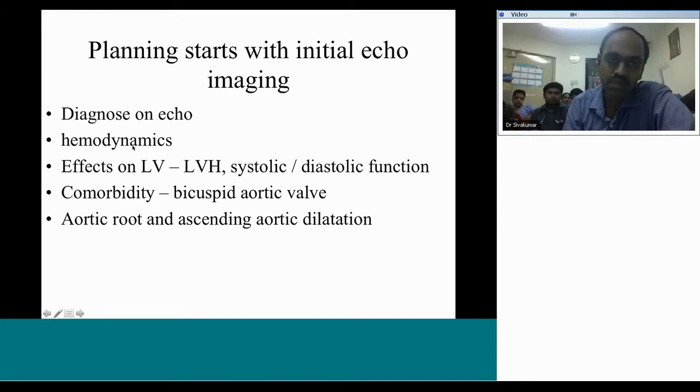So that means blood pressure clinical assessment between upper limb and lower limb, and if the pressure difference is more than 20 millimeters of mercury, then that becomes an indication for coarctation stenting. You sometimes may do a coarctation stenting even with less than 20 millimeters of mercury in cases where there is an exercise-induced worsening of the blood pressure, or the patient is having significant LV dysfunction, or PDA, or aortic regurgitation, or extensive collaterals that may mask the coarctation gradients.